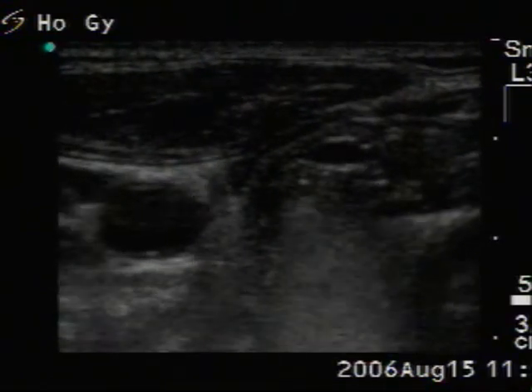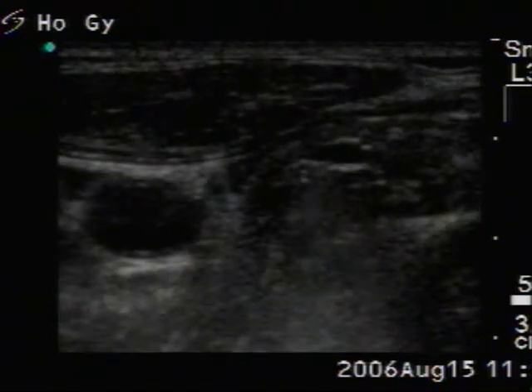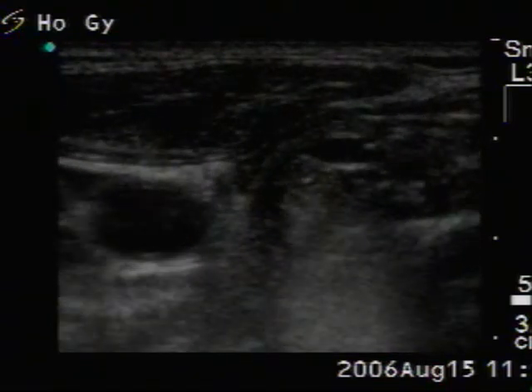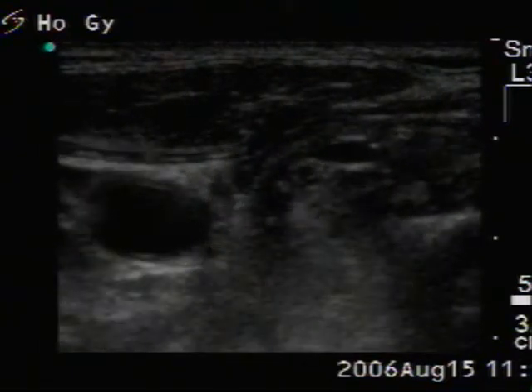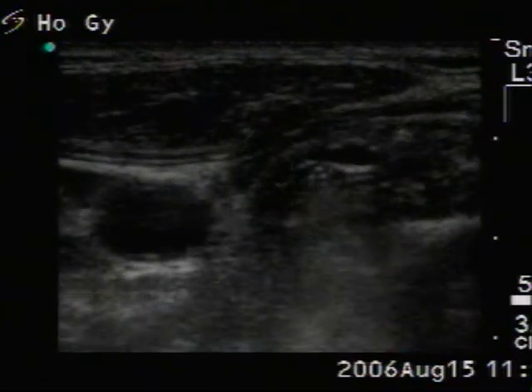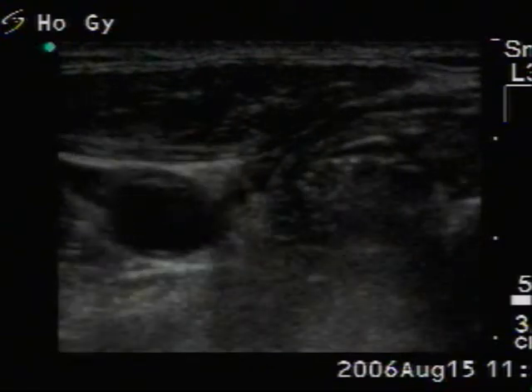In the case of such a small nodule, it is best to avoid the movement of the needle during sclerotherapy. If the patient swallows during the session, we need to check the position of the needle.